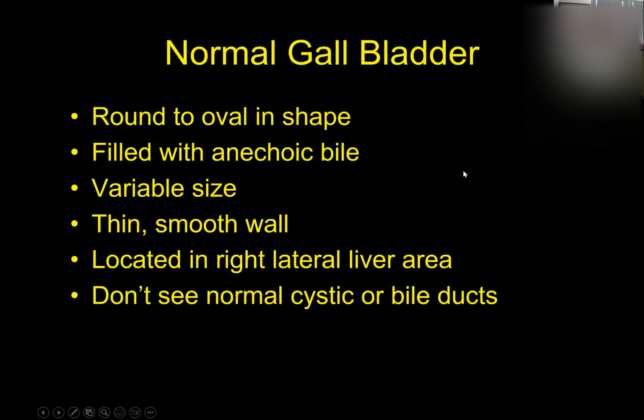Okay, then we'll end today with the gallbladder. The gallbladder, remember, is one of those organs you don't typically see radiographically, but we have to know it's there. It lives in the right cranial abdomen, surrounded by liver tissue. With ultrasound, we can see the gallbladder in every case, unless it's been removed, or sometimes if it has nothing in it.